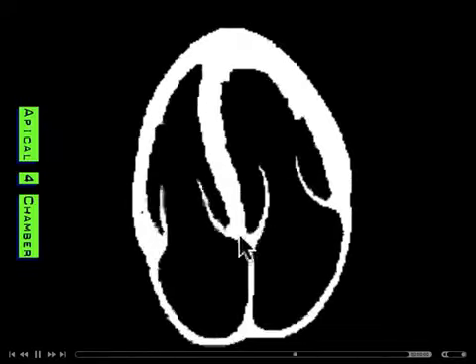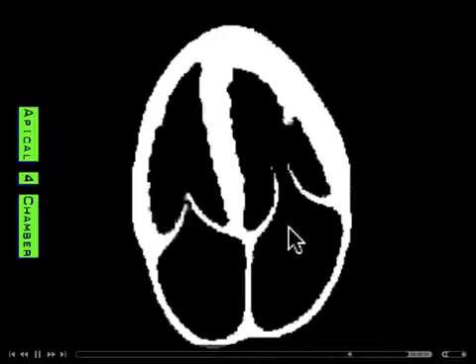By the way, the aortic valve is snuggled right up in here. We're going to get to that in a minute, but that's where the aortic valve is. Once the blood is coming out during systole, it's being pumped out of this LV, assuming there's not much mitral valve regurgitation. In other words, the blood is not going this way, but right down into this little area that's out of the plane of view. It's a little bit more anterior, and that's where the aortic valve is.